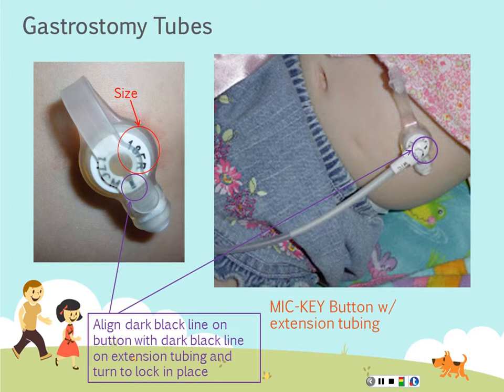The nice thing about the gastrostomy buttons or enteral feeding buttons that are placed this way is that they can be hidden under the kid's clothes. They don't pull at them as much. If it's a kid with cystic fibrosis or something like that that's going to have problems with feeds and needing to grow, and so they're going to have extra feeds, it's going to help with is they can go to school and have this button and no one's going to know it's there. And so it's not going to cause an issue with body image or things like that.